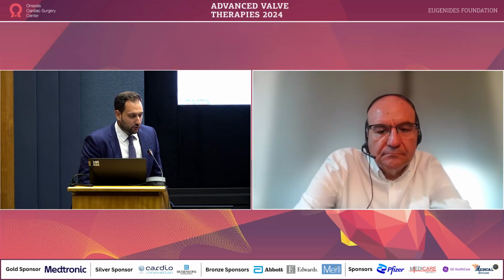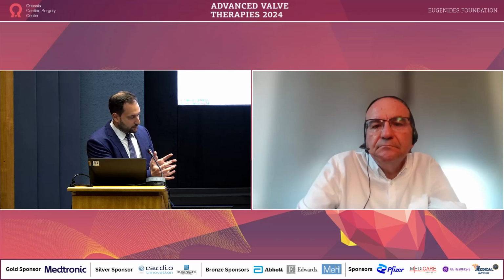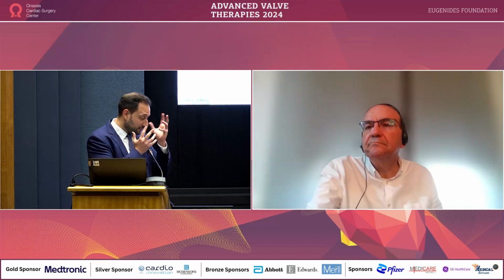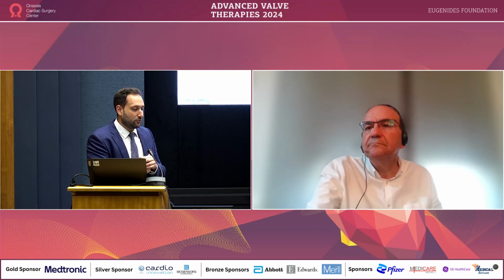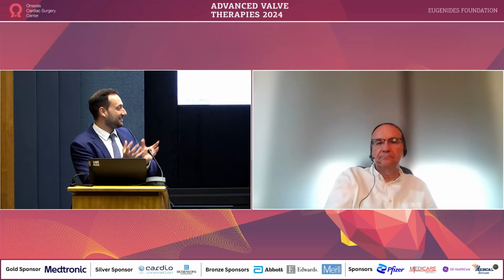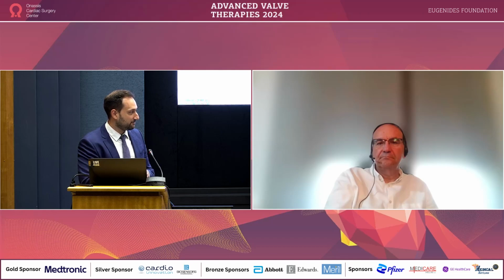Exactly, that's a great question. The same way it calculates the compliance of the annular calcifications and gives you the risk, the stretch and risk for rupture, the same way it calculates the compliance of the annulus when the prosthetic valve is deployed. And based also on the shape of the annulus and the ellipticity of the annulus, it gives you this prediction. It's been validated with many cases where the patient had the TAVR, then they went back and did the analysis depending on the PVL, and that's how they validated.